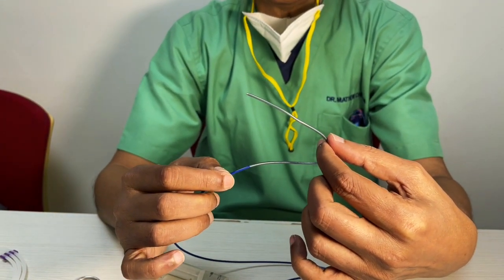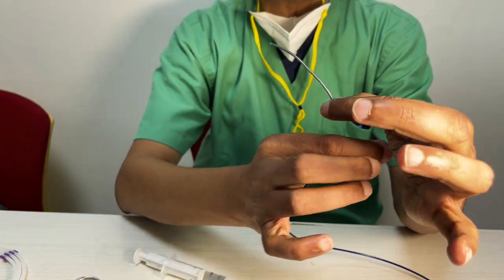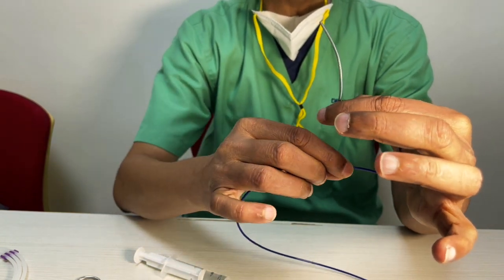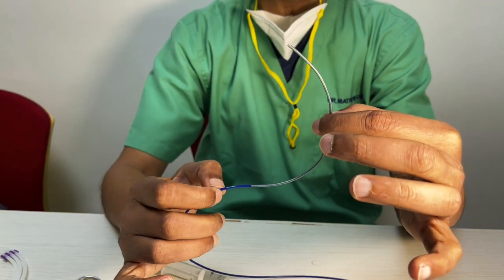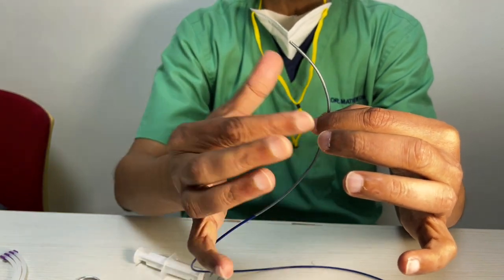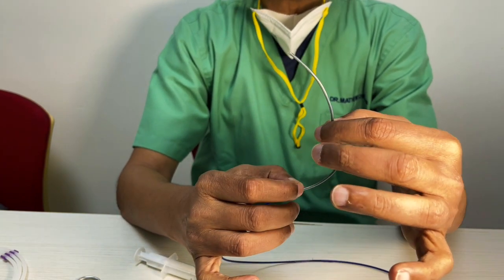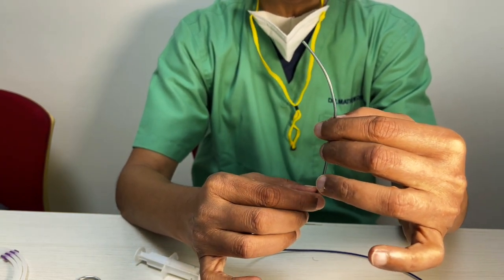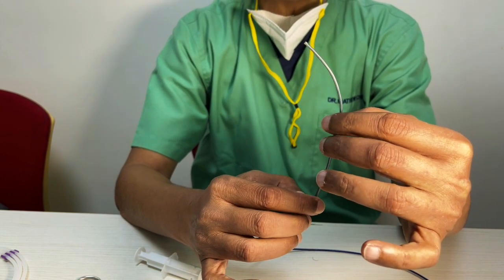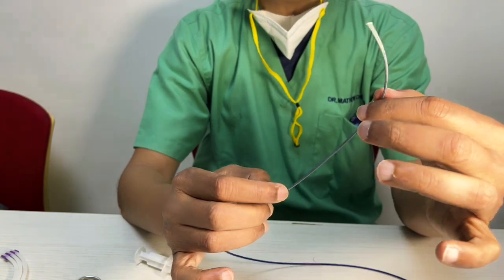If you're going to have a bend like this, remember when you try to push now, it will tend to go into the arch. You get this? It's going to move into the ascending aorta as you push it. The only way you can avoid this is if you have something that straightens this completely and does not allow this to take place. So for that, we need a long sheath. You get this point? So that's why we found out that it is much safer to work in the head and neck region with a long sheath to prevent this.